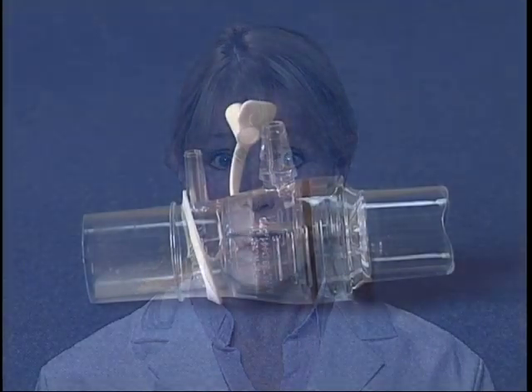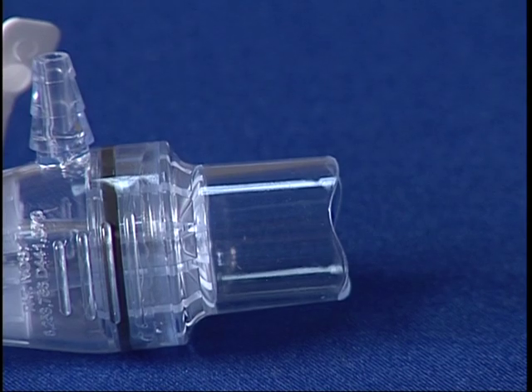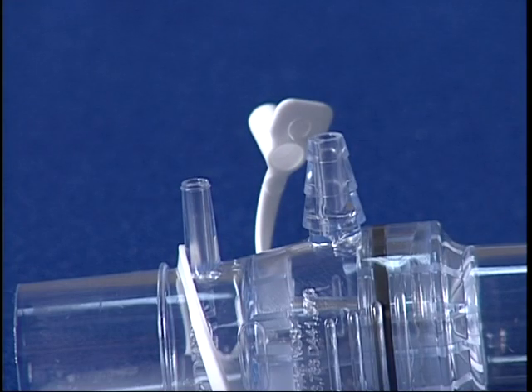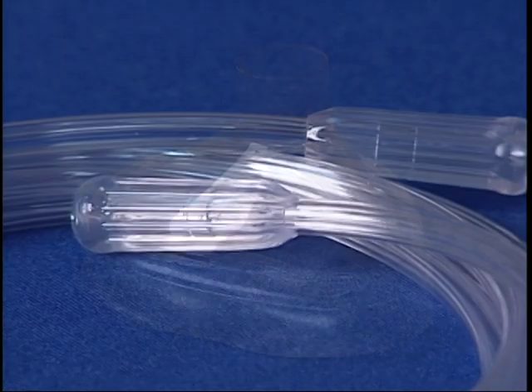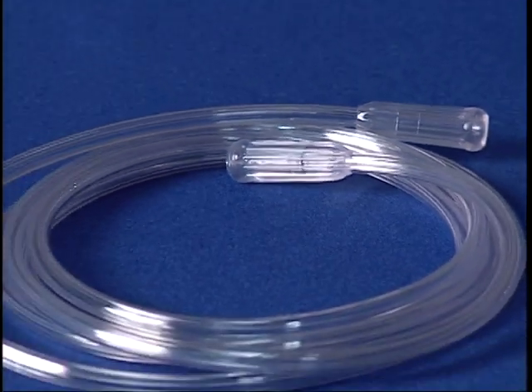The EZ-PAP system consists of the following items: the positive airway pressure device, including an ambient air inlet with a 22 millimeter serrated connection, a gas inlet port, and a pressure monitoring port with cap. The patient interface is a mouthpiece or mask, and a 7-foot length of oxygen tubing to connect the gas inlet port to the wall flow meter.